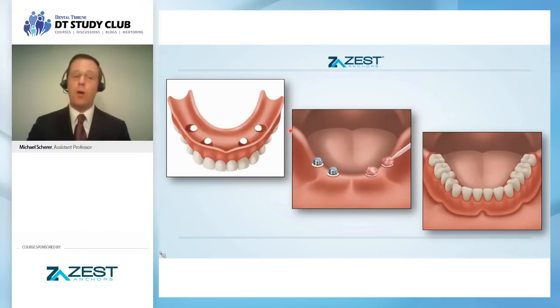And it's a light pressure. I don't want to put a significant amount of pressure because I tend to find that if I have a light pressure, it's intimately adapted to the tissues but not overloading the tissues. And ever since I've really adopted this clinical philosophy, my maintenance issues have gone down tremendously.